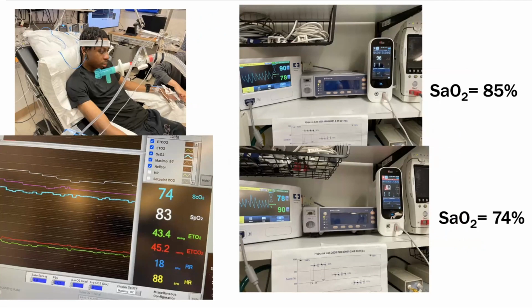And so his perfusion index, I'm sure I can read it from this, I believe it was around 1. So it wasn't terribly low, definitely not high. You know, in San Francisco, we do warm our subjects' hands, but sometimes we are successful in getting their hands warm, and other times probably not as much.